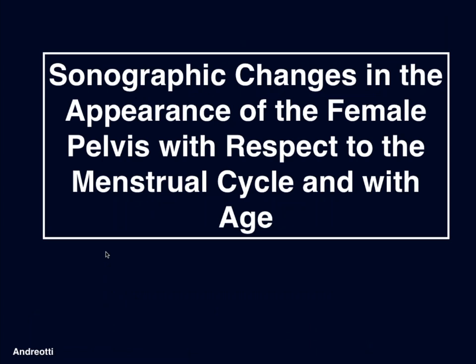So now let's move on to look at sonographic changes in the appearance of the female pelvis with respect to the menstrual cycle and with age.